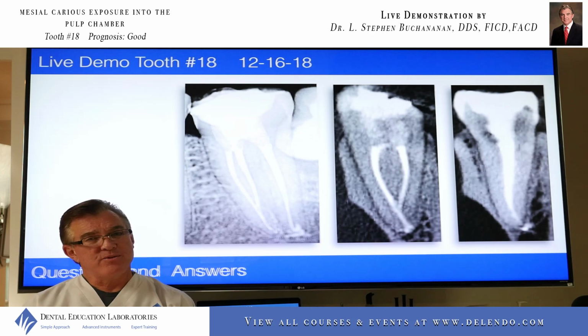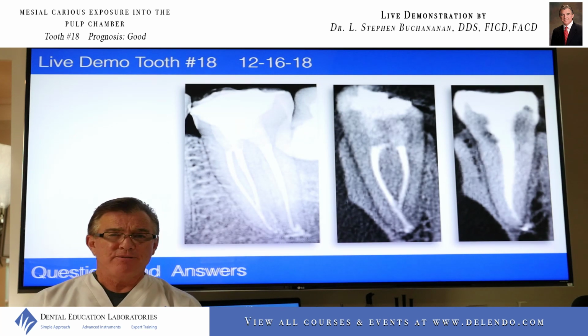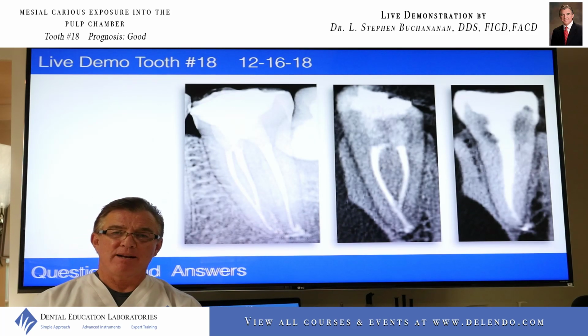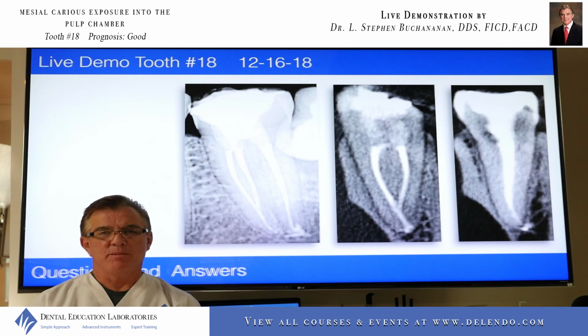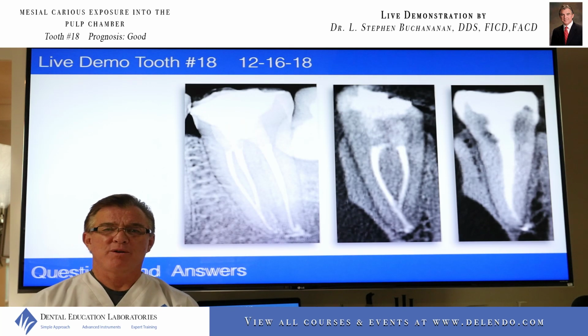We're working our way through this new technology. It's very exciting to be able to broadcast live to anywhere in the world. I've been waiting for this to come to fruition for about 15 or 20 years. And that is going to do more to share techniques with other dentists around the world than almost anything else we've done in dental education besides 3D printing. So this is a wonderful medium, a great way to communicate. I love doing live demonstrations because it just kind of ups the ante, makes it more interesting.